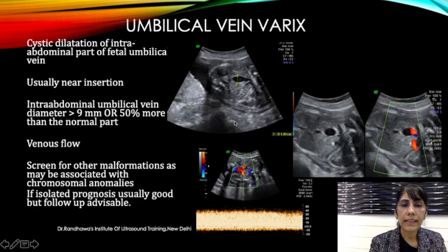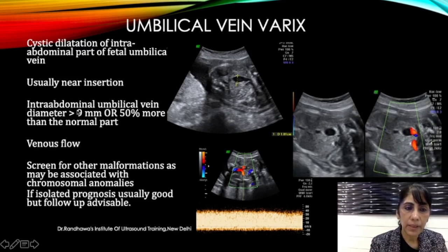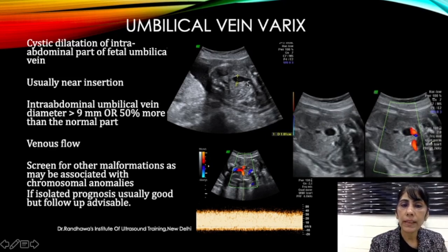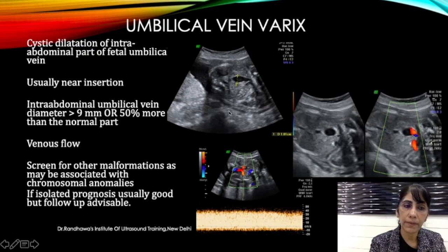What do we do next? We measure the maximally dilated area. If the measurement is more than 9 mm, that is significant. Alternatively, you can compare it with the normal part of the umbilical vein — the varix would be more than 50% dilated compared to the normal part of the vein.